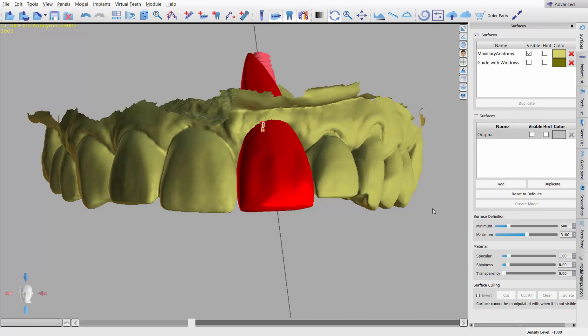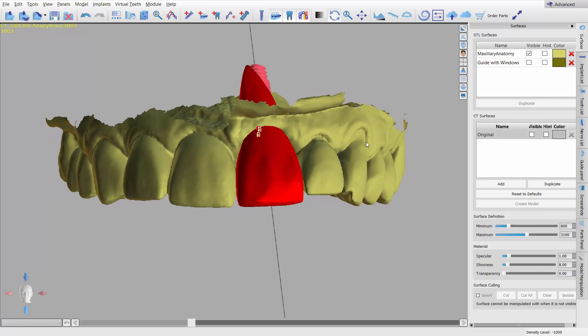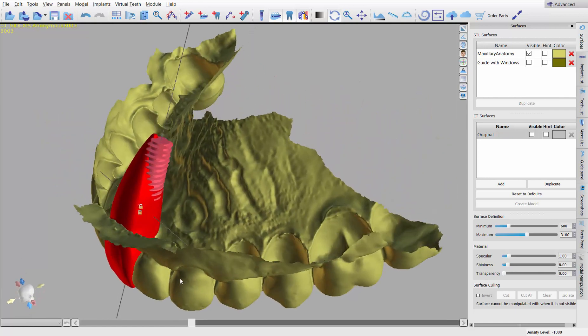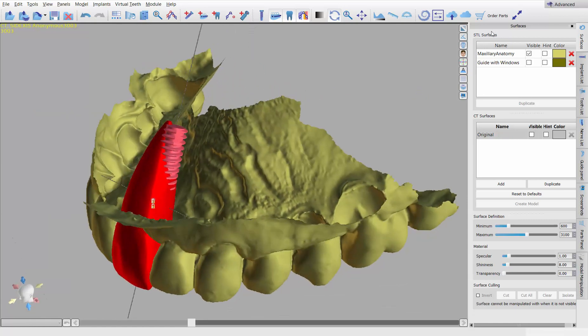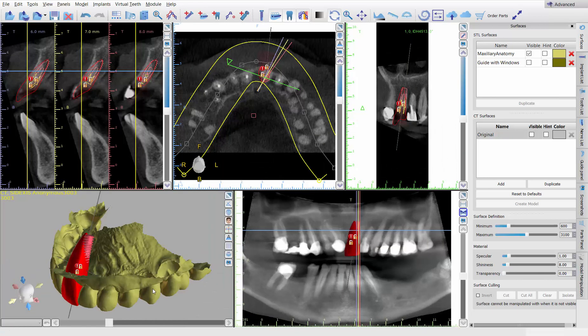So here we go. In this first video, I'm just going to show you, this is going to be a combination of Blue Sky Plan and Mesh Mixer. So the first video is basically going to be what we need to export from Blue Sky Plan. And as you can see in this case, I've already planned my implant.